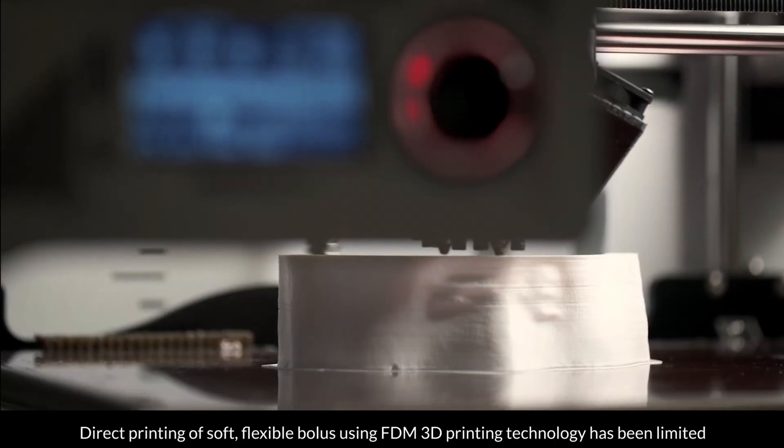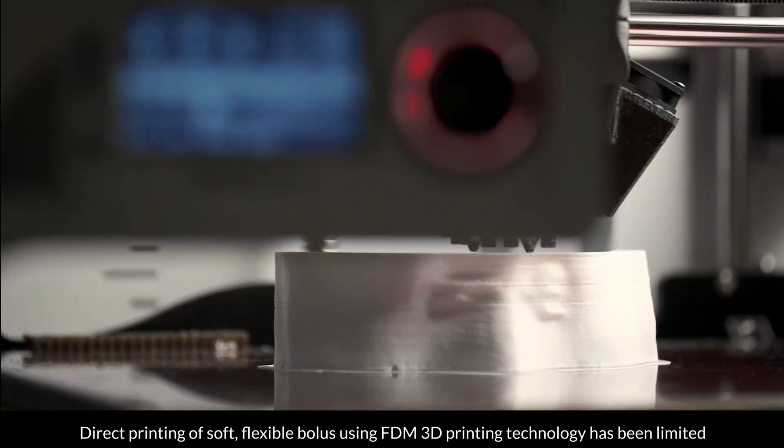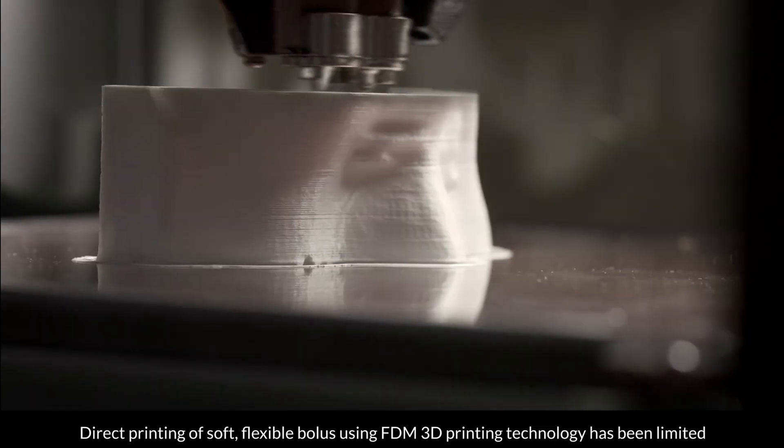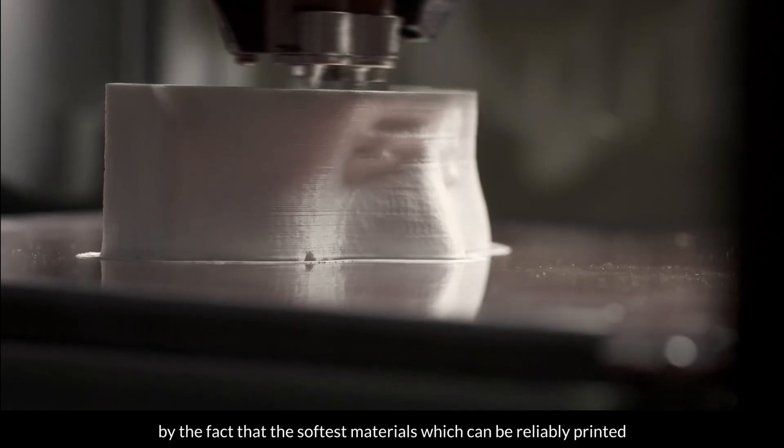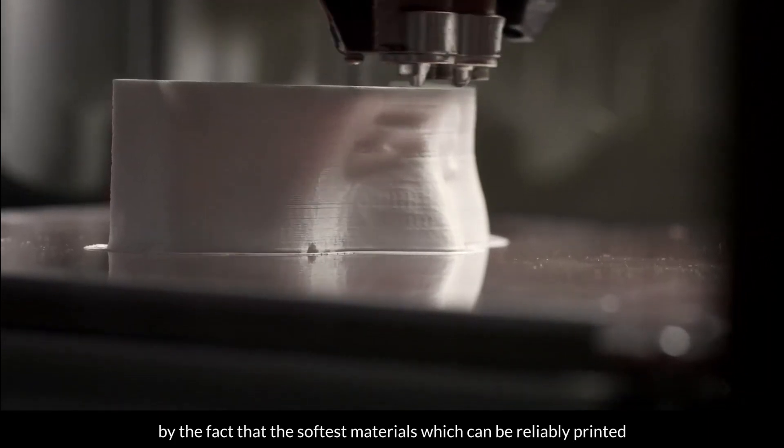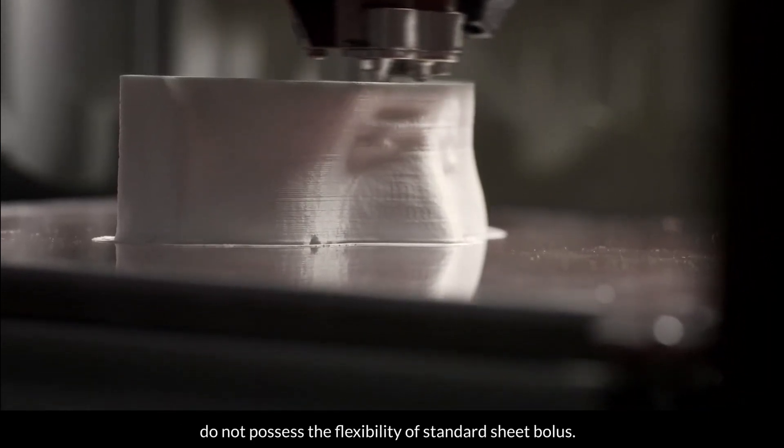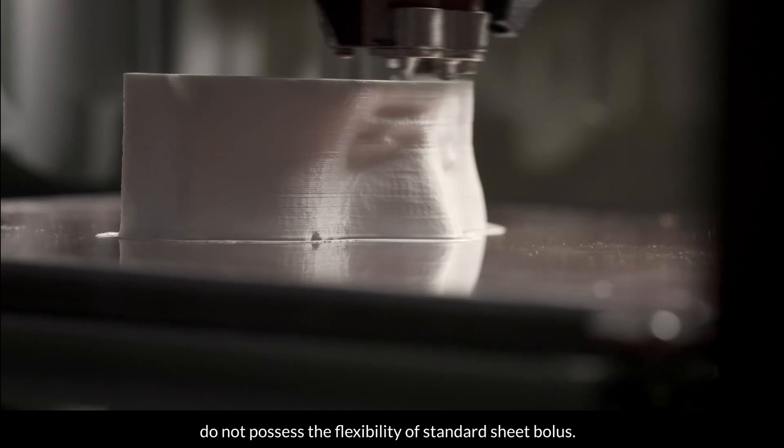Direct printing of soft, flexible bolus using FDM 3D printing technology has been limited by the fact that the softest materials which can be reliably printed do not possess the flexibility of standard sheet bolus.